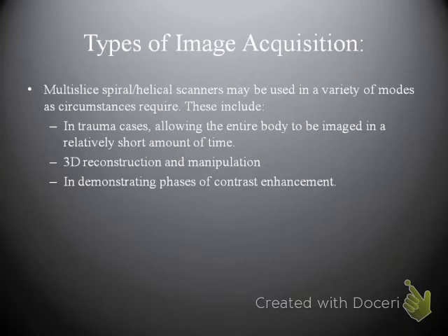Also, we use multi-slice CT in demonstrating phases of contrast enhancement. Multi-slice CT has really come into its own in multi-phase organ enhancement, such as liver studies, where you catch arterial and venous flow, CT runoffs, things like that, to where we can really see these vessels adequately.